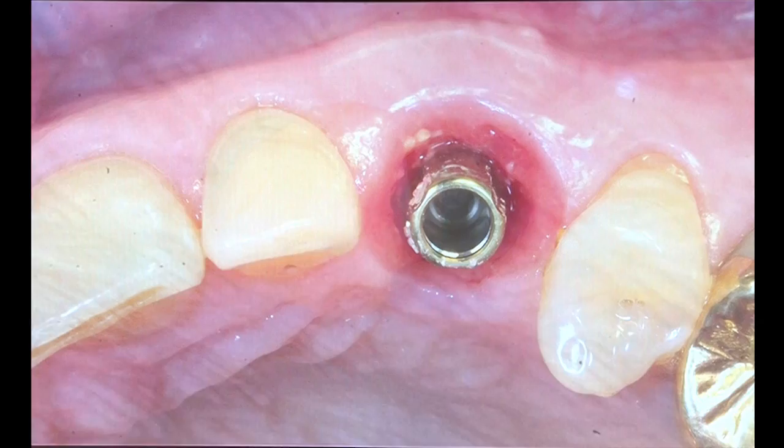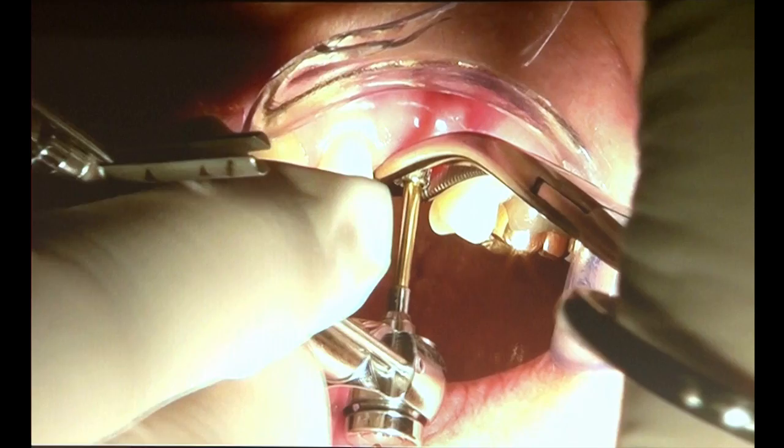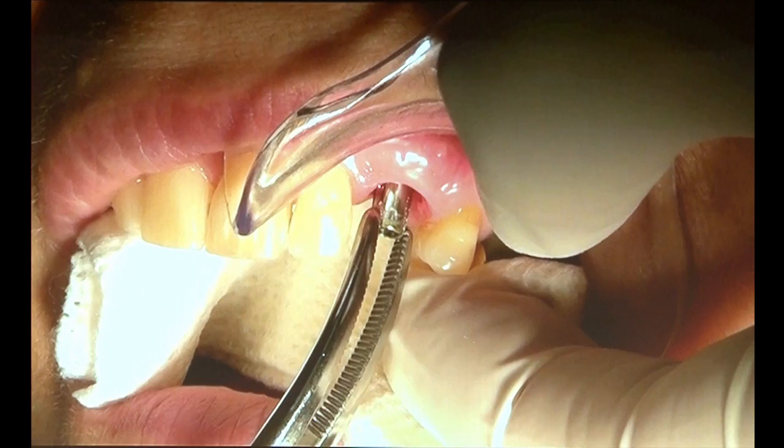This is the contour of the provisional crown. You can see the maturation of the soft tissue. And here, when we remove it, again, apply resistance with a hemostat as you're loosening the abutment screw. Again, because you're not sure where the healing process is with that implant. It could be progressing very nicely, or it could be heading into the danger zone.